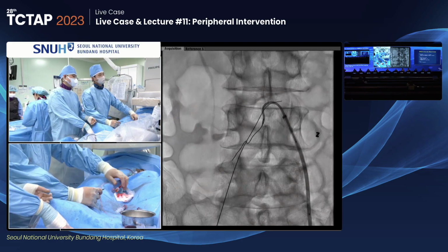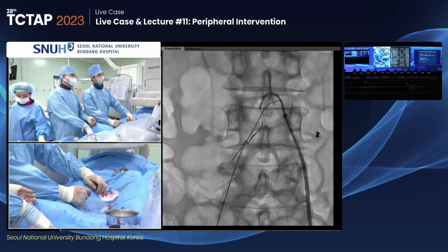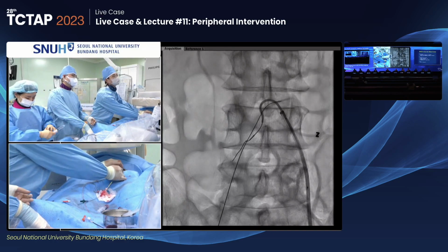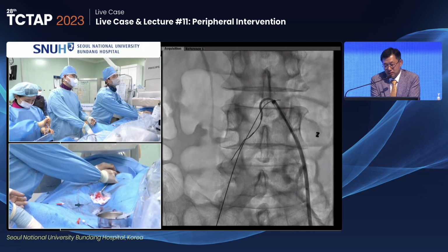Advance the CXI first, then the loop, pushing the guide wire. But to make a strong support, it is unsafe with the sheath across the aortic bifurcation. Oh, it's difficult. Yes, difficult.